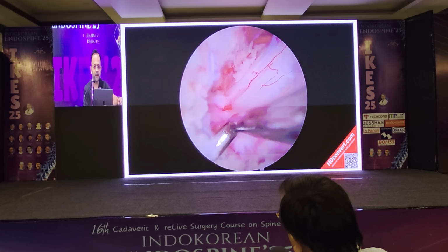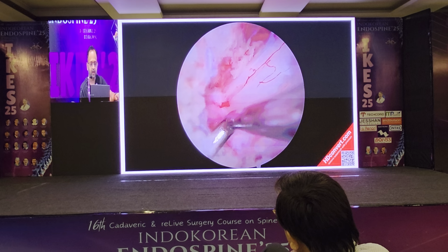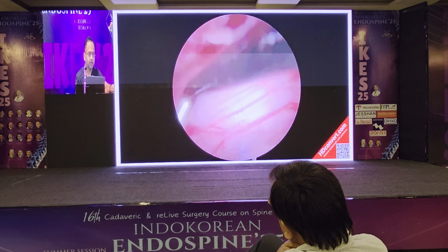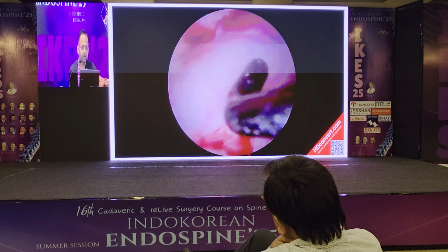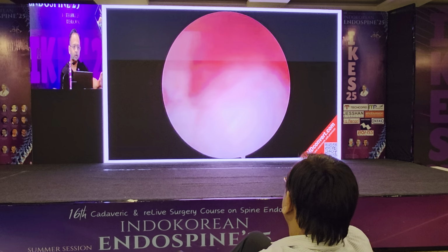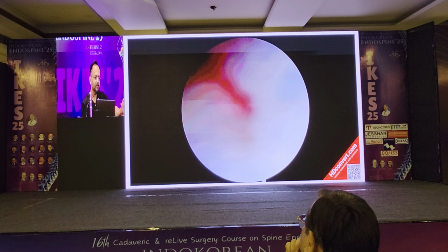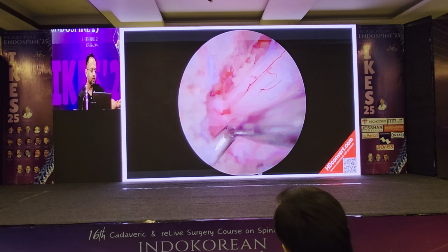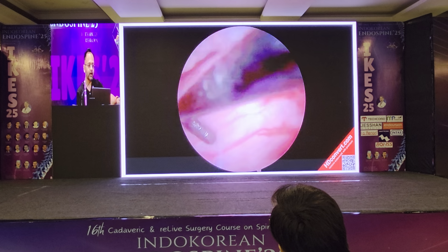In cervical spondylotic myelopathy, the patient has already gone through extended segment degeneration and asked for 2-level ACDF. We started doing up to 3-level cervical laminectomy with a single incision. This is from C3 to C6 laminectomy with a single port. Safely achieved both. It's kind of a floating laminoplasty. The spinous process base is removed, but the spinous process is left over. But bilateral decompression, I think you can see it is well achieved. And even the bowing effect of the cord has gone.